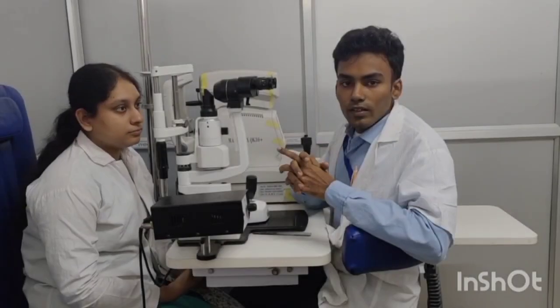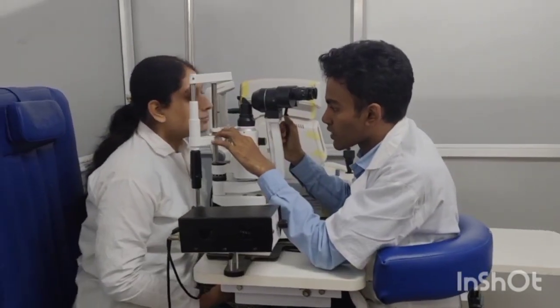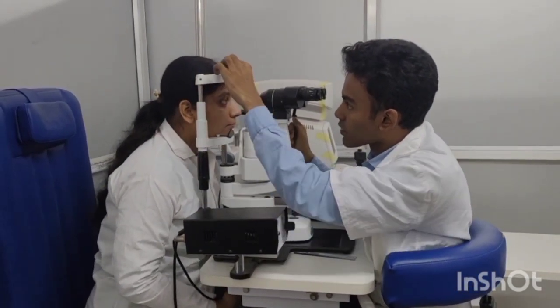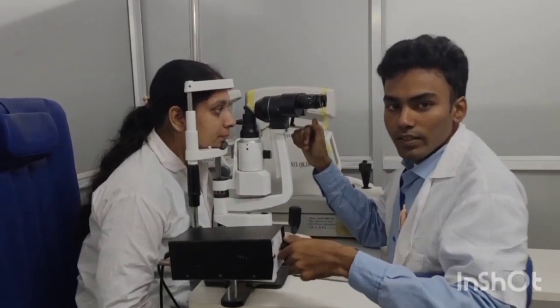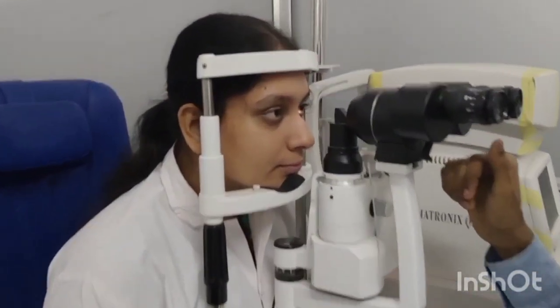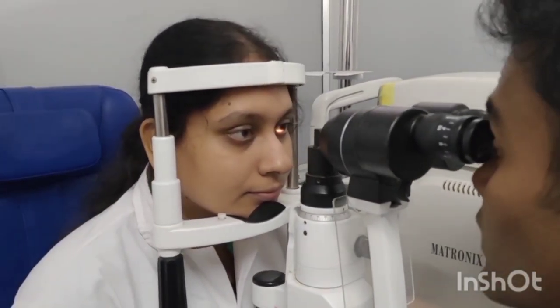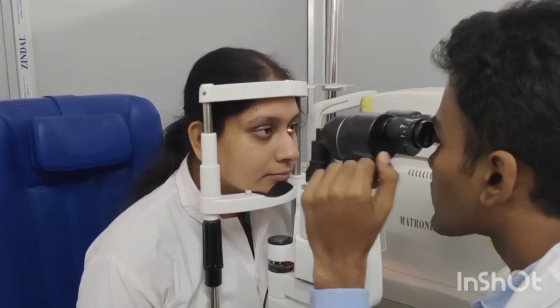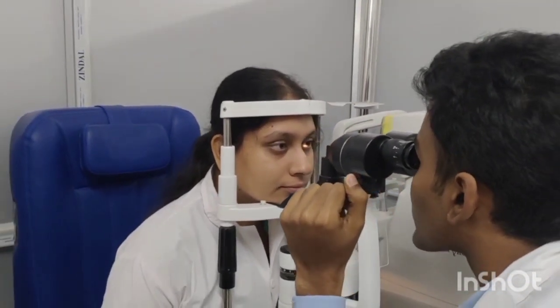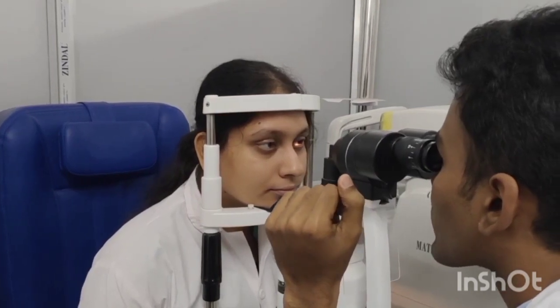Okay, I will instruct the patient about the proper positioning of the head. So you please put your chin here and touch your head with this headrest. Okay, then I will illuminate the slit lamp by rotating the switch, and then after focusing the IPD, I will just focus this to the patient's eye. Okay, so it will be in focus.